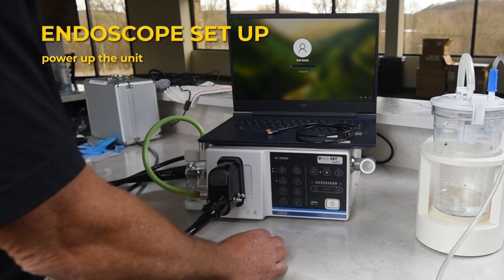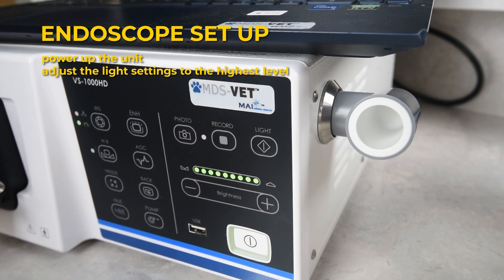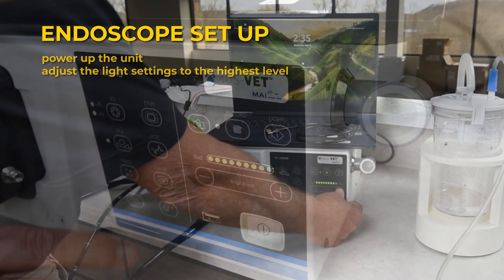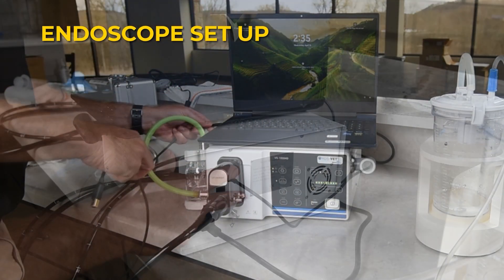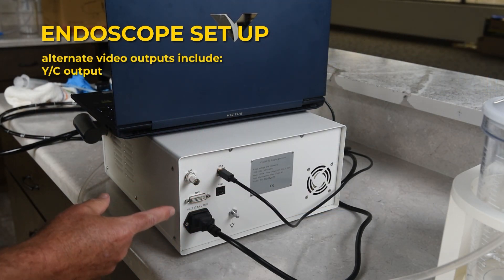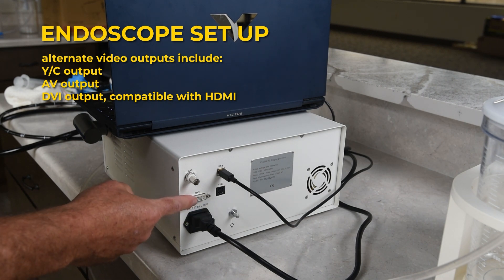Power up the unit and adjust the light settings to the highest level. Connect your laptop using the provided USB cable and launch the Debut Video Capture software. Alternate video outputs include a YC output, an AV output, and a DVI output. DVI is compatible with HDMI, so you can connect directly to any monitor with an HDMI input.